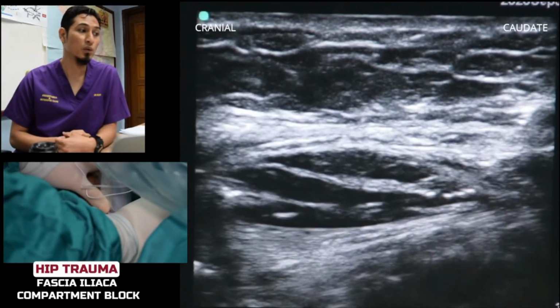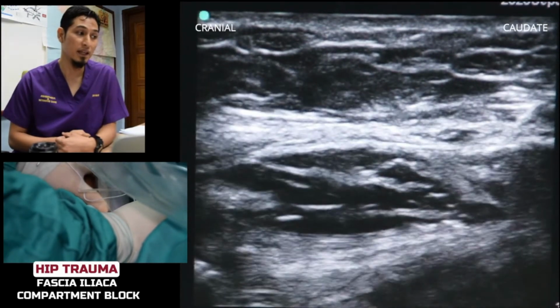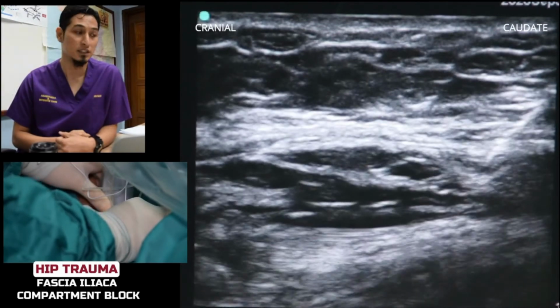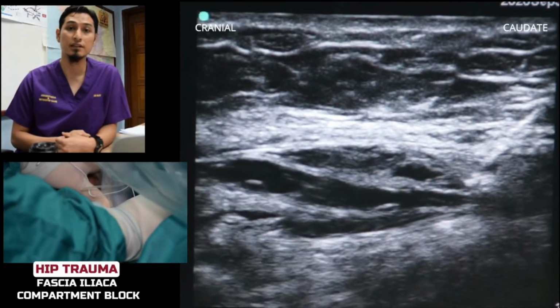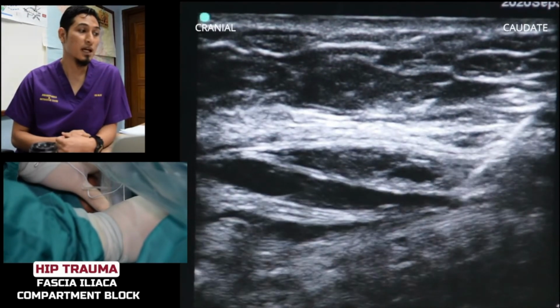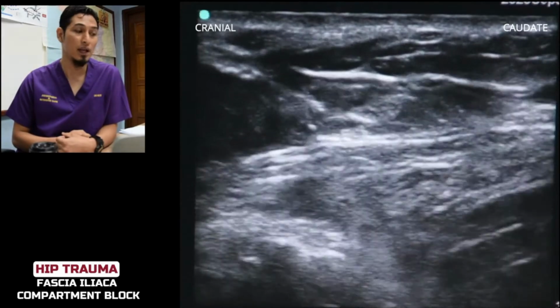Okay, so there is some space created by the LA, so we are going to dive in our needle a little bit and we inject some more LA into that space. So now we are going to check the spread of our LA.